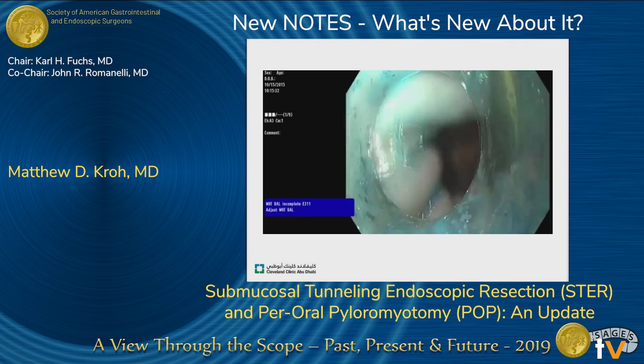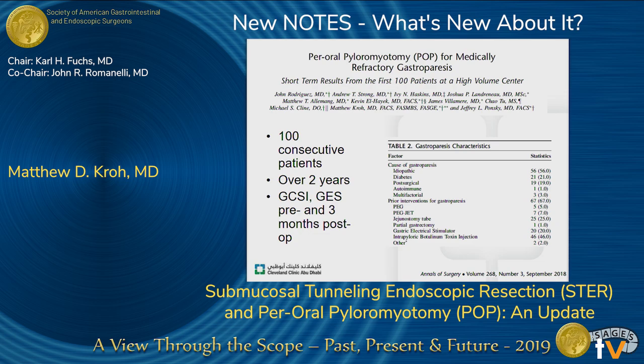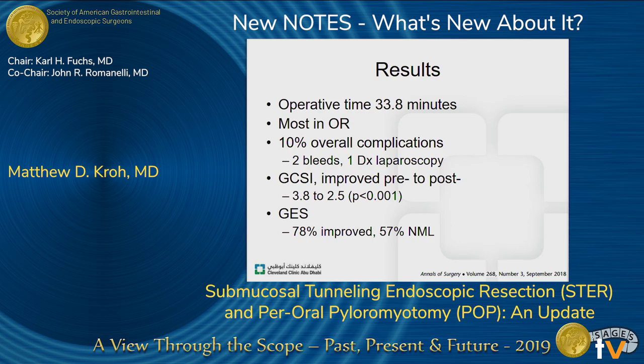All right, how about outcomes? So this is our experience from Cleveland Clinic, our first 100 patients over the course of 2 years. We looked at GCSI and non-extrapolated four-hour solid phase gastric emptying study pre and 3 months post-op. If you look at the demographics of these patients, a little bit different than other gastroparesis indications. This included not just idiopathic and diabetic, but also post-surgical and multifactorial. So a pretty broad spectrum of patients. Operative time was about 33 minutes. Most of these were done in the operating room, but we have transitioned to do these in the endoscopy suite now. 10% overall complications, 2 bleeds requiring either transfusion or reintervention, and 1 diagnostic laparoscopy.